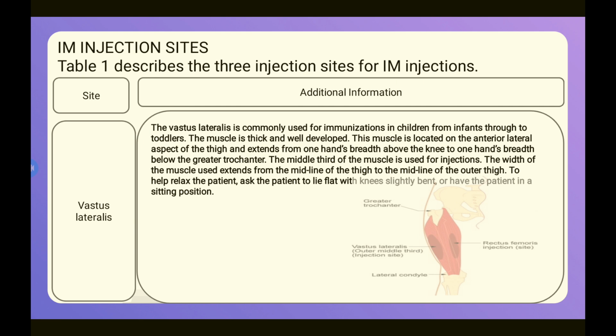The width of the muscle used extends from the midline of the thigh to the midline of the outer thigh. To help relax the patient, ask the patient to lie flat with the knee slightly bent, or have the patient in the sitting position.